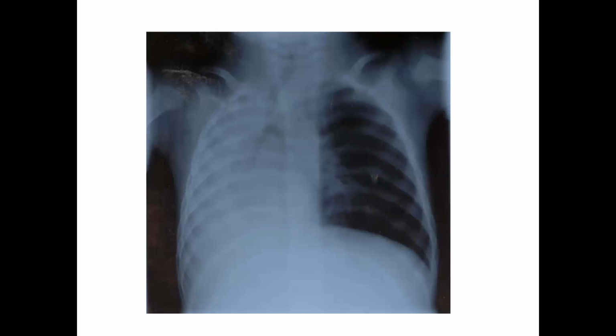So that puts off radiation as well. Then you've got MRI, ultrasound, echocardiography. Those items don't emit radiation per se. So with the other items, you would want to make sure that you're wearing a lead apron and protect your thyroid pretty well. But the other items don't necessarily have to have that.